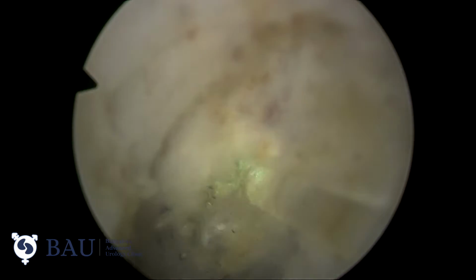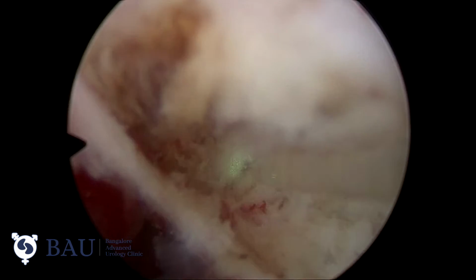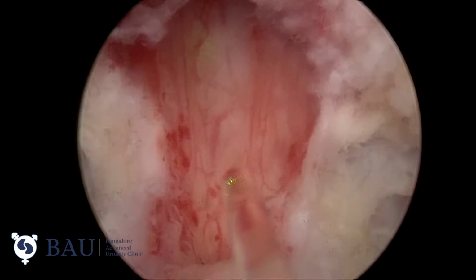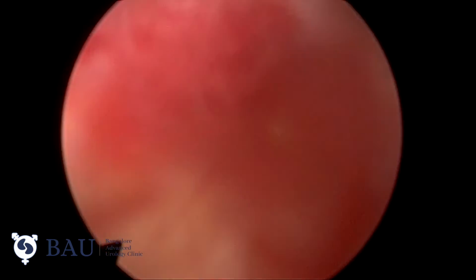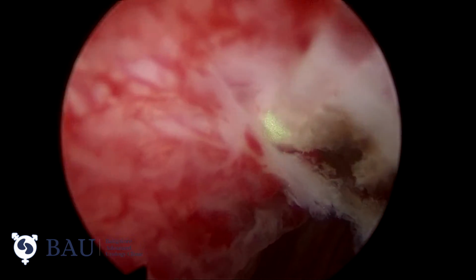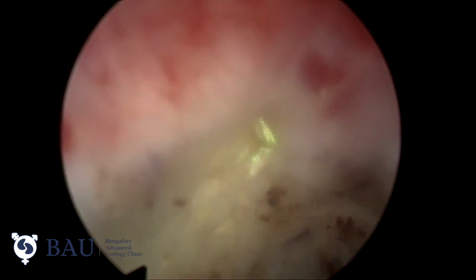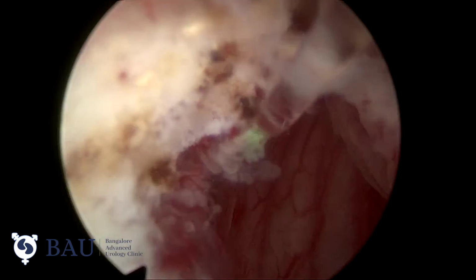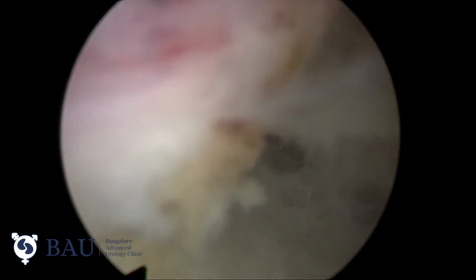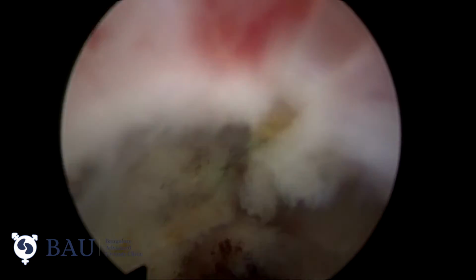As soon as you identify the correct plane, as long as you are getting a good plane, you can proceed with the dissection. And now I am cutting the mucosa on the right side of the patient. As soon as you cut the mucosa, you can clearly appreciate the mucosa moving distally and the prostatic lobe moving proximally. As soon as you get the correct plane, you can proceed in that plane.